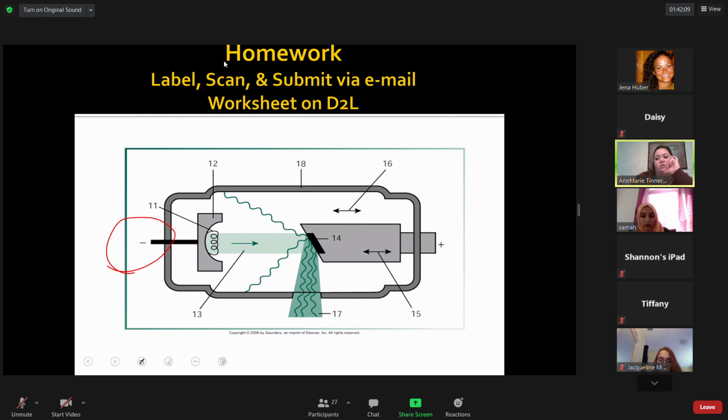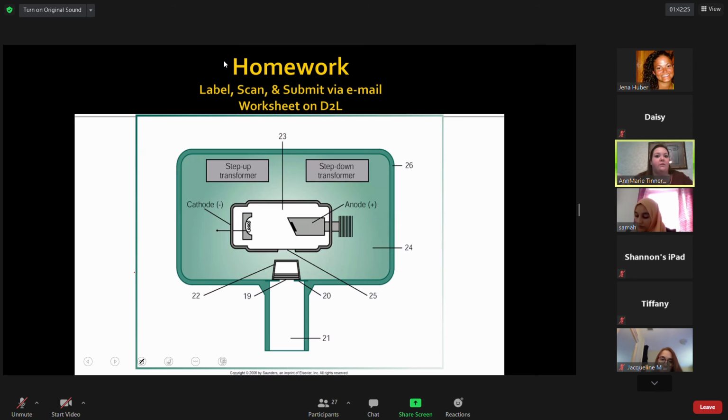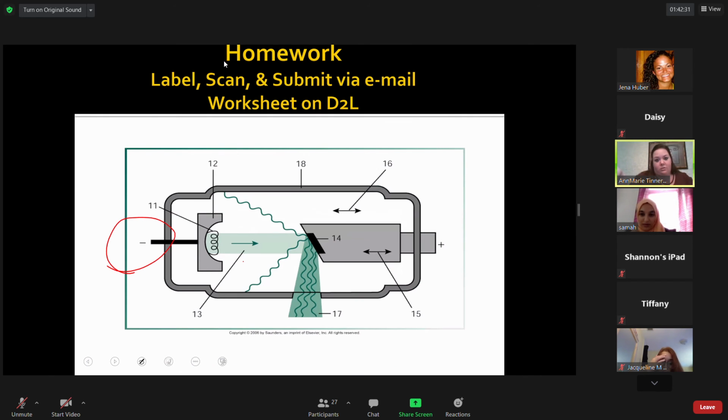Just a little clue here. If I'm having you do this as homework, it's most likely going to be on a quiz, right? So make sure you know the parts, okay? Make sure you know that this is the glass window that's located within the tube head. It's this portion here. You're just looking at it closer, okay?